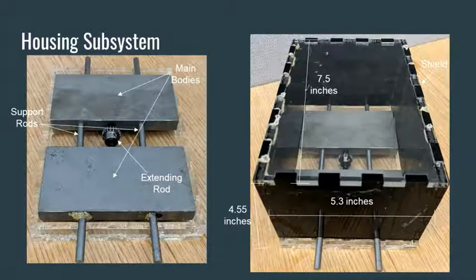The shield also doubles as a mechanical safeguard by attaching to one of the main bodies and extending 15 millimeters past the face of the other main body. The maximum distance we would want the device to expand is 15 millimeters, so having the device expand that far beyond that face would be another way to help prevent the device from overexpanding.